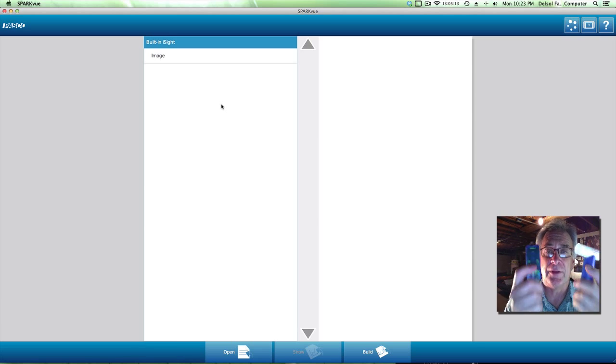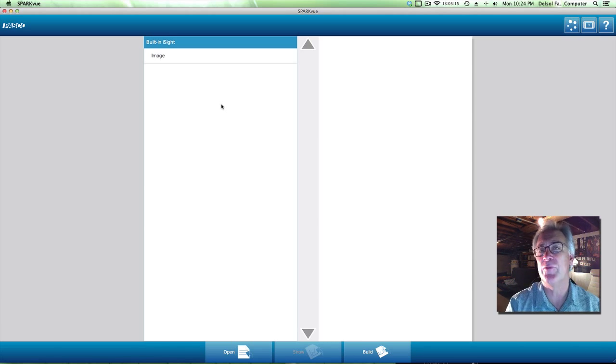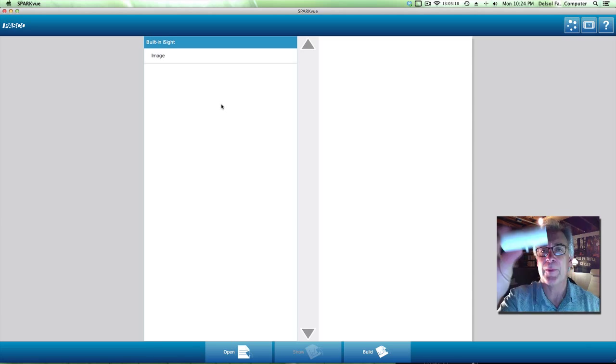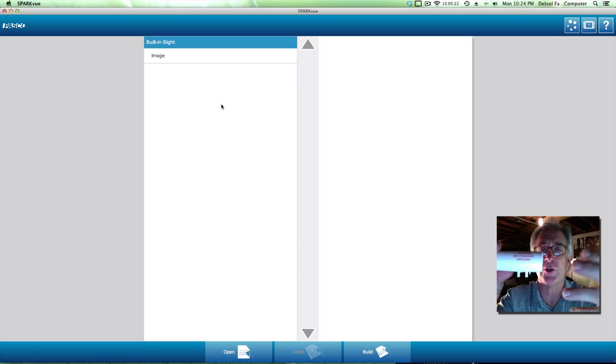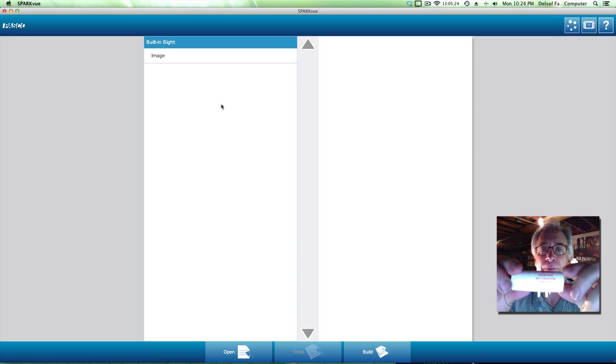Before I plug this in, I want to go over a couple of features that you need to know about. The mouthpiece, of course, is disposable, so once the subjects use it, we need to throw it away.